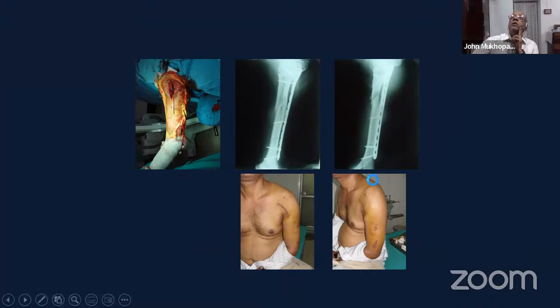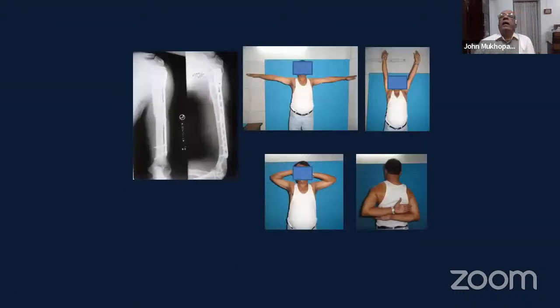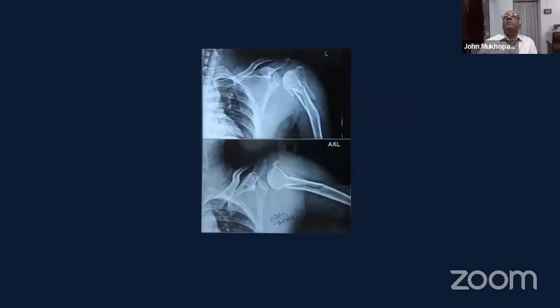The other thing you do here is go through the V of the deltoid. Since it's a long plate, if you go either anteriorly or posteriorly, you will not be along the humerus. So you go through the V of the deltoid, which is on the lateral side, make a small incision there, and you can get the plate through it. And here at follow-up, you can see how this fracture has healed very well with a good range of motion. Here's another case.